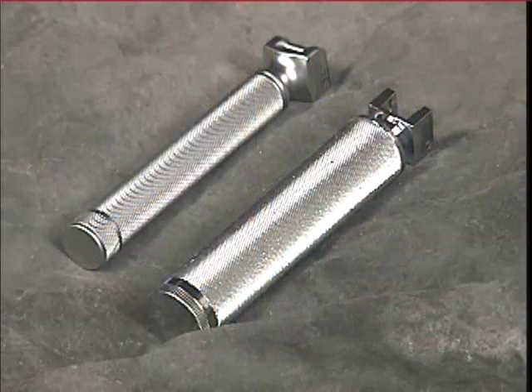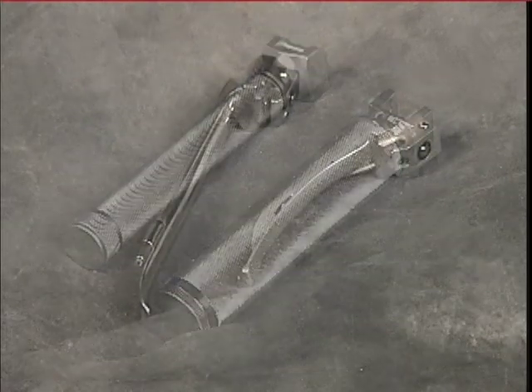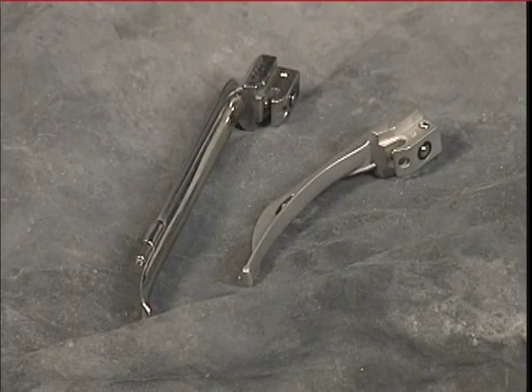The laryngoscope usually comes in two pieces: the handle and the blade. There are generally two sizes of handles, one for the adult and one for the pediatric patient. The blades come in several sizes, either straight or curved.